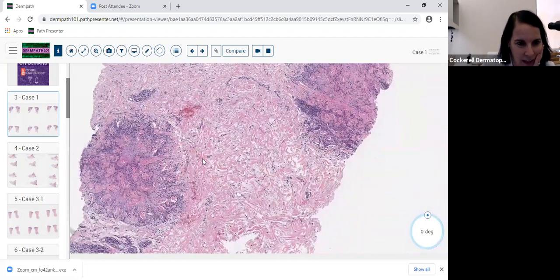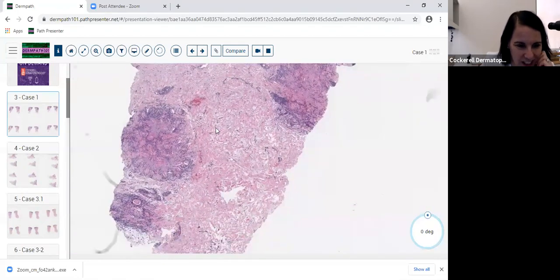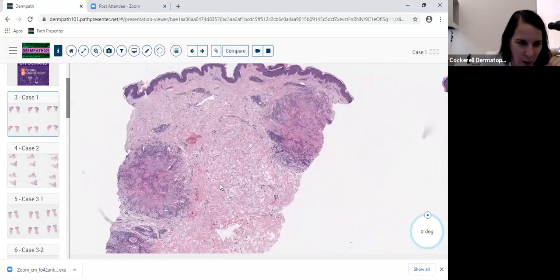Other things in the differential, well, there's rheumatoid nodule. With rheumatoid nodule, you'll have a location, extensor surfaces, and it'll be much deeper. You'll typically see it in the subcutis. You'll see much more well-formed granulomas and more fibrinoid areas in the center, less mucin and more multinucleated giant cells. So that's why you wouldn't think about a rheumatoid nodule here at all. And also it's multifocal, so you wouldn't think about rheumatoid nodule. So those are some of the things in the differential I wanted to talk to you about.